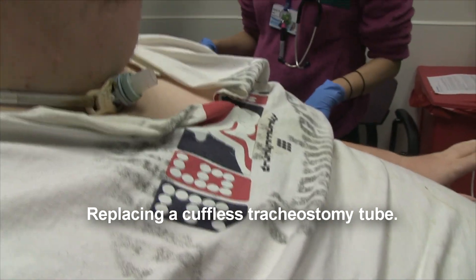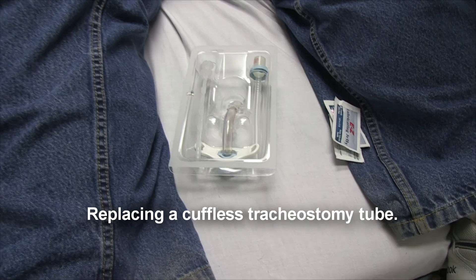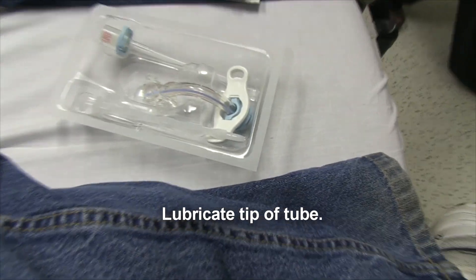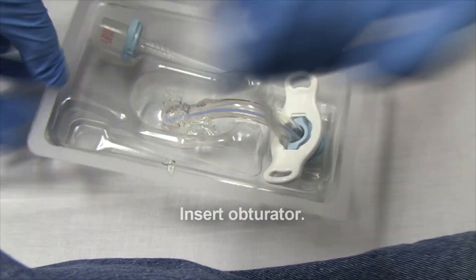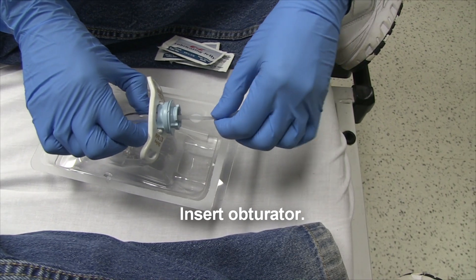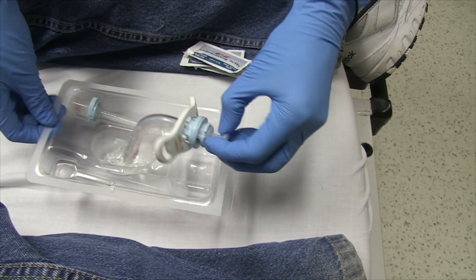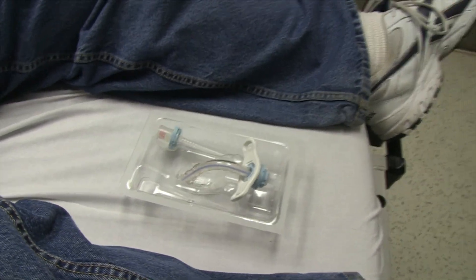He says he's going to close — time to prepare myself. It gets him a little anxious. Right now I'm just putting lube on the end of it, and then we're going to put the obturator in. I appreciate you being willing to do this. All right, so that's ready.